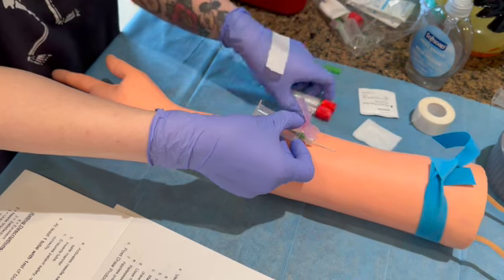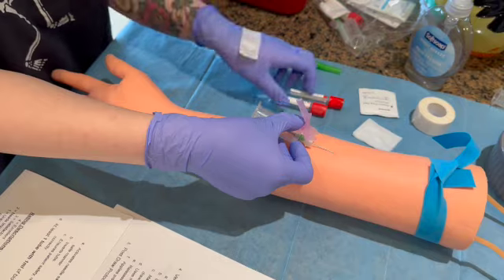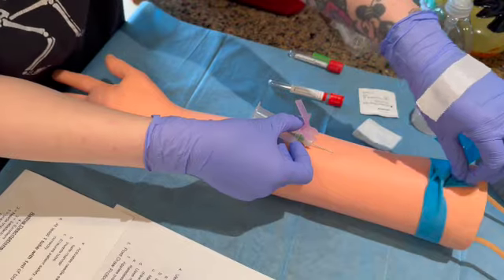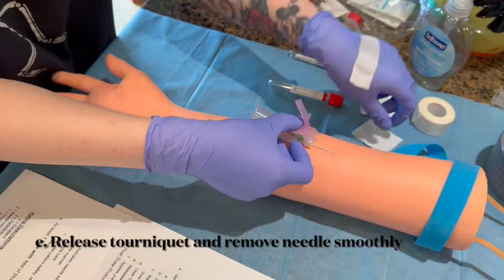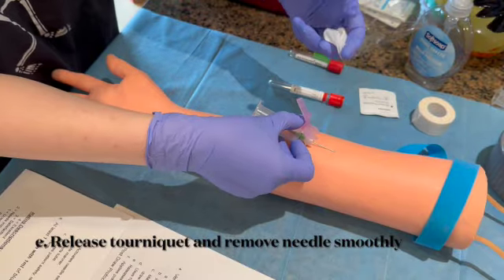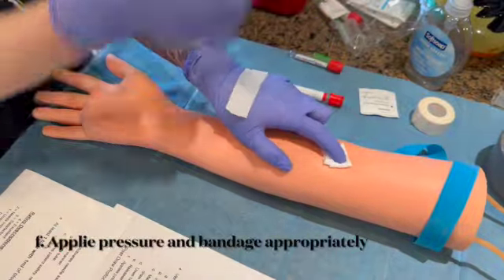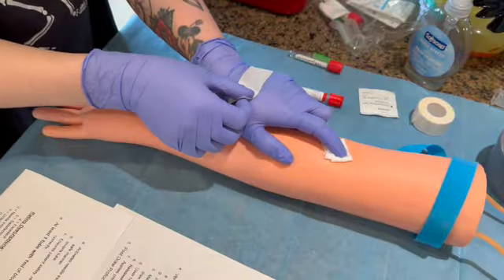So he's not flowing. Hopefully we can get it with the butterfly. I can't figure out how to get his blood to actually flow well. Let's say we've got our 2 tubes of blood at 1 mil each. We're now going to make sure that we're ending the venipuncture, so releasing the tourniquet before that needle comes out, and that we're going to be removing the needle safely by preparing our gauze and hovering it, and remove safety pressure. And then this guy goes straight into the sharps container. And we're going to apply our pressure here.